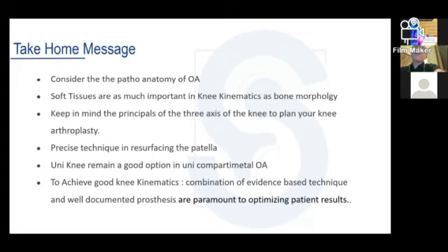We rarely use that, and we rarely recommend that in our environment if not everything is prepared. Bilateral knee is a surgery which should be reserved for a specialized center with a specialized team, with a minimum level of education for the patient and for the team.